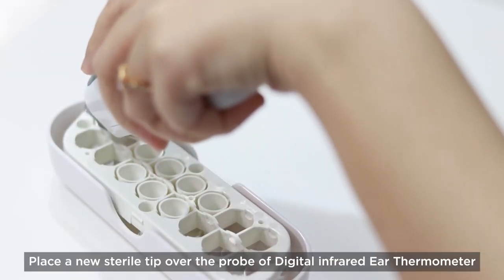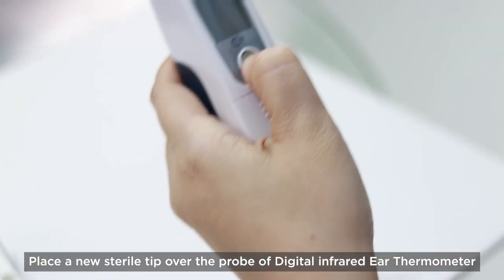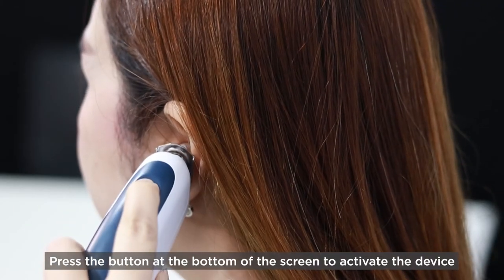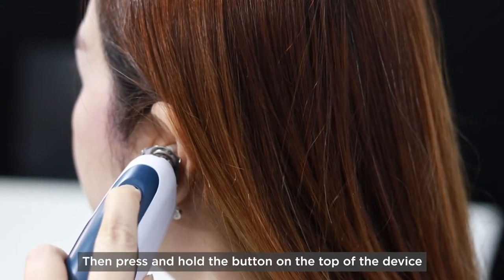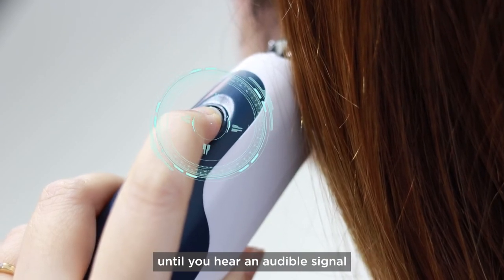Place a new sterile tip over the probe of the Digital Infrared Ear Thermometer. Press the button at the bottom of the screen to activate the device. Insert the tip of the probe into the ear canal, not too deep or too shallow. Then press and hold the button on the top of the device until you hear an audible signal.